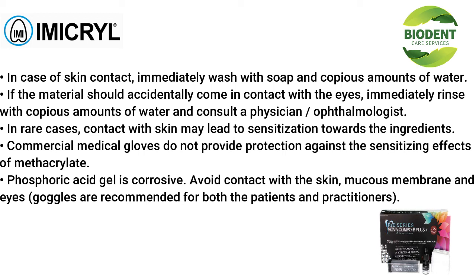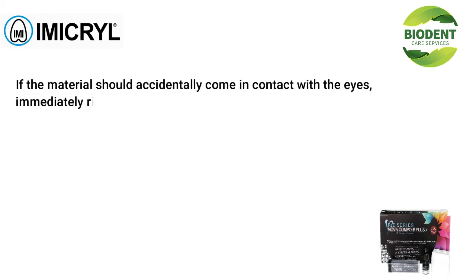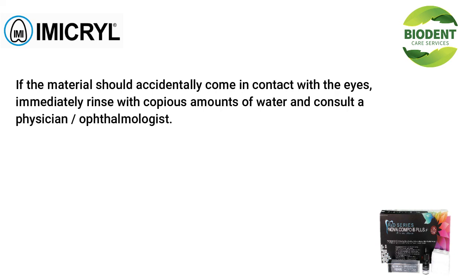Phosphoric acid gel is corrosive. Avoid contact with the skin, mucous membrane, and eyes. Goggles are recommended for both the patients and practitioners. If the material should accidentally come in contact with the eyes, immediately rinse with copious amounts of water and consult a physician ophthalmologist.